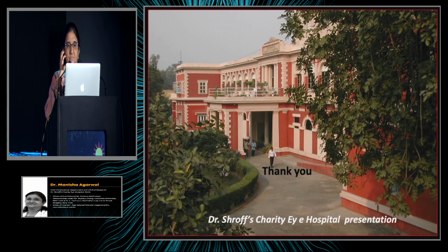We've been really highlighting the advantages of ultra-wide field imaging. One of the things I forgot to mention previously, particularly when we're talking about tumours, is we do have to be careful about the pseudo-colour, because often we can get misled, particularly with choroidal hemangiomas. They can look pigmented, and if you haven't looked in the eye, you can be misled as to what it actually looks like.